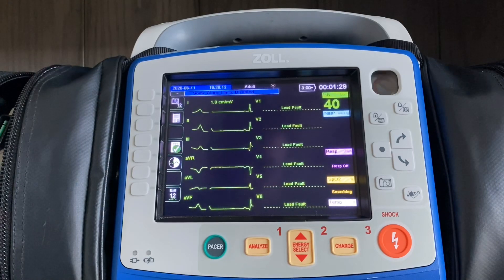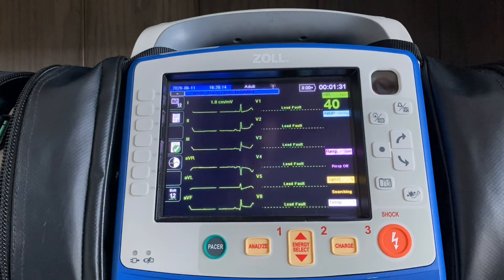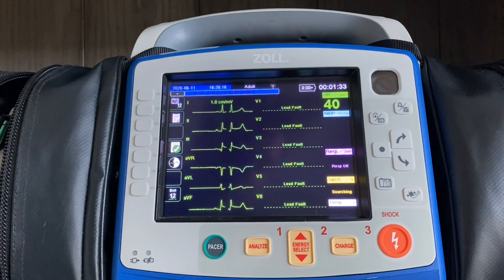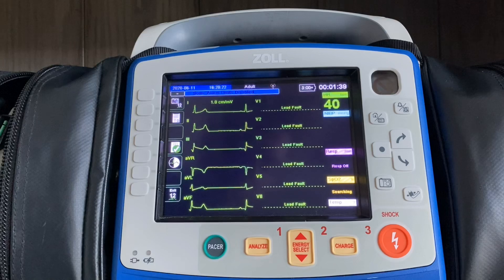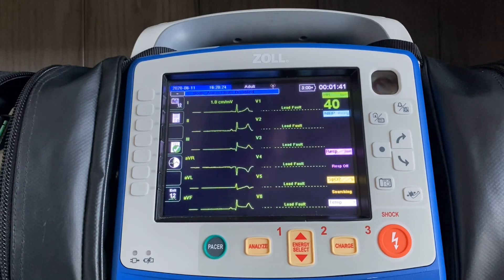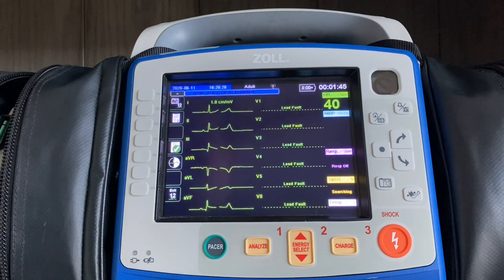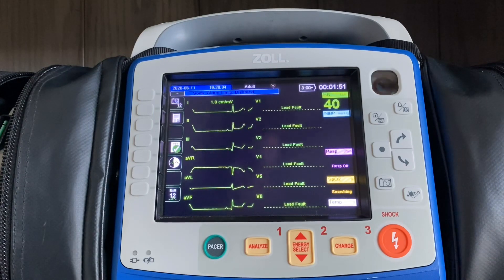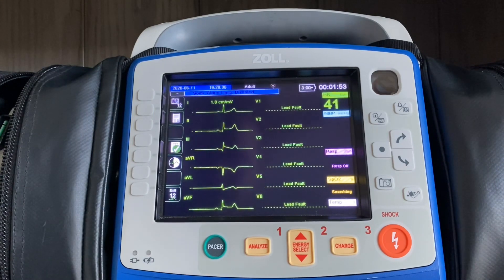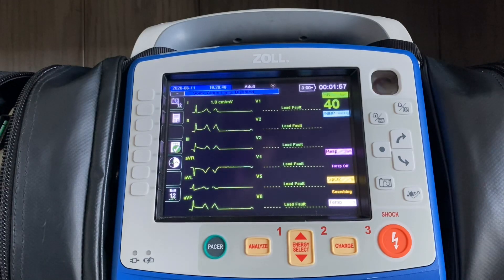Now based on your health system and your EMS system, that could be important if you're expected to confirm DOA in multiple leads. You could get away doing that with just hooking up the limb leads, acquiring, and transmitting this strip to the hospital without hooking up a full 12-lead to a dead person. Now for a chest pain call, we want to go ahead and place the V leads on the patient as well — those V leads on the patient first, prior to hooking into the junction point in the cable.